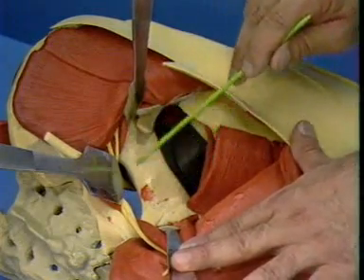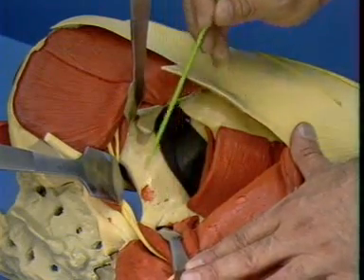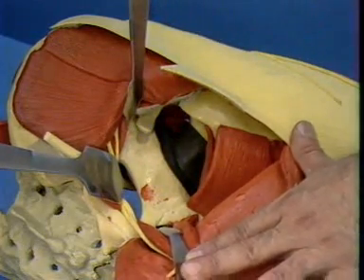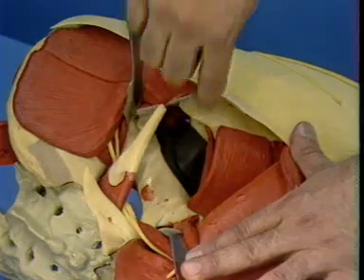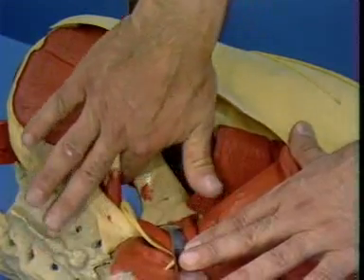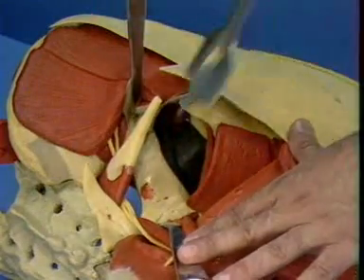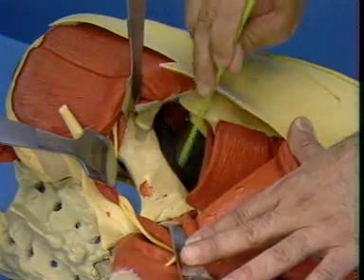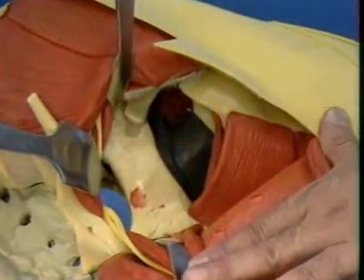The entire retroacetabular surface is now exposed from the superior portion of the ischial tuberosity to the inferior ilium. The quadrilateral surface and pelvic brim can be accessed by palpation through the greater sciatic notch. The interior of the joint can be visualized by performing a capsulotomy along the rim of the acetabulum.